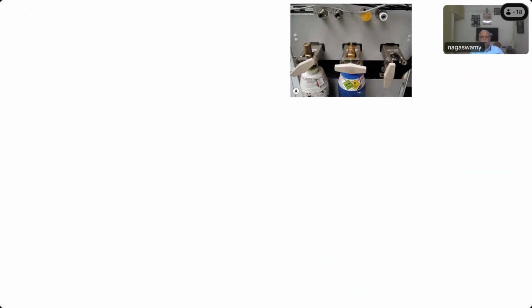Now this is the hanger yoke assembly, which you are using every day nowadays. This is the back side of your anesthesia workstation with the same yoke assembly, where you can see a spare oxygen cylinder fixed, a nitrous oxide cylinder, and an empty yoke available for another cylinder. And what are all these things? Pipeline inlet, sir. The whole thing is called the panel. Unlike the older machines, where there is a separate attachment for cylinders and a separate attachment for the pipeline supply, here they have incorporated all these into one place.